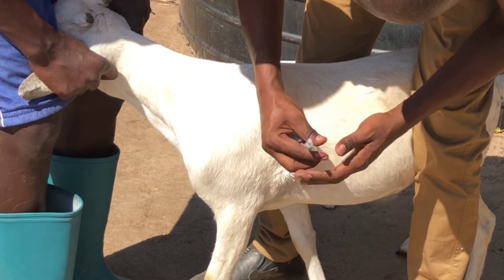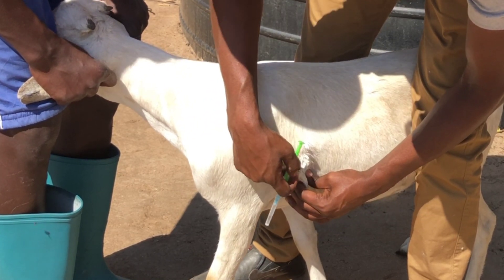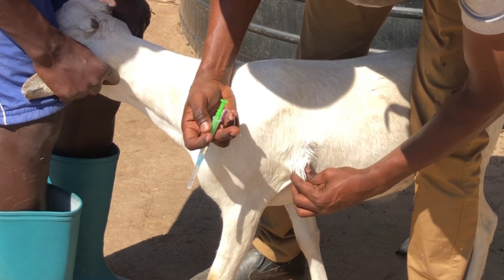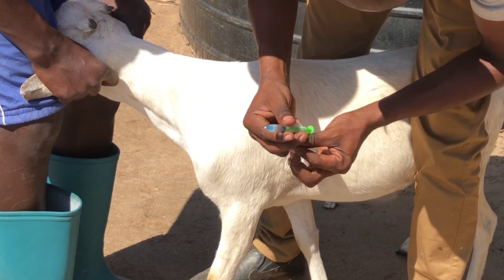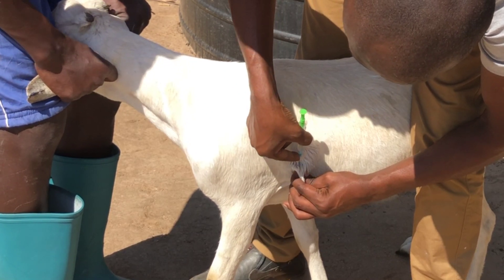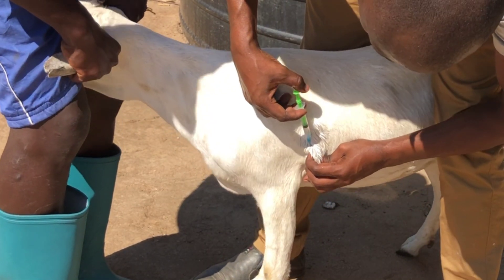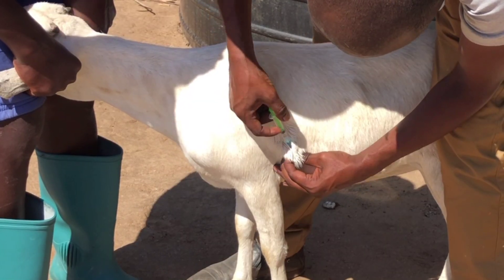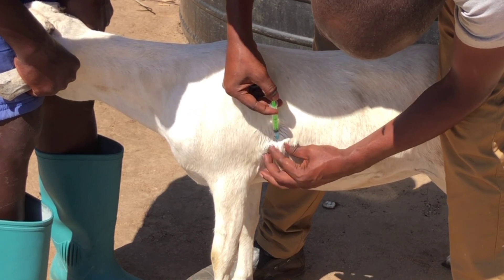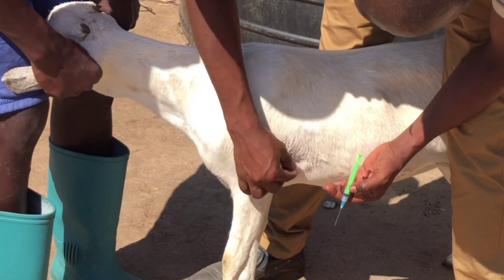The area is clean. This is how we grab the skin — we want to reach in between the skin and the meat or flesh. This is how we grab it. Take the cap off, grab this area well, then push in the syringe making sure the needle is not into the meat — it's in between the skin and the meat. That's where it is. Then we push in our vaccine, and once we've pushed it in we cleanse the site again.